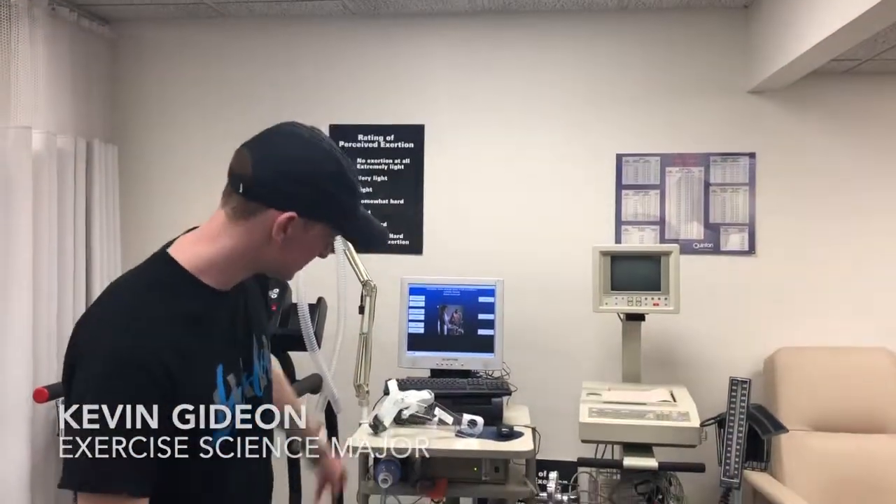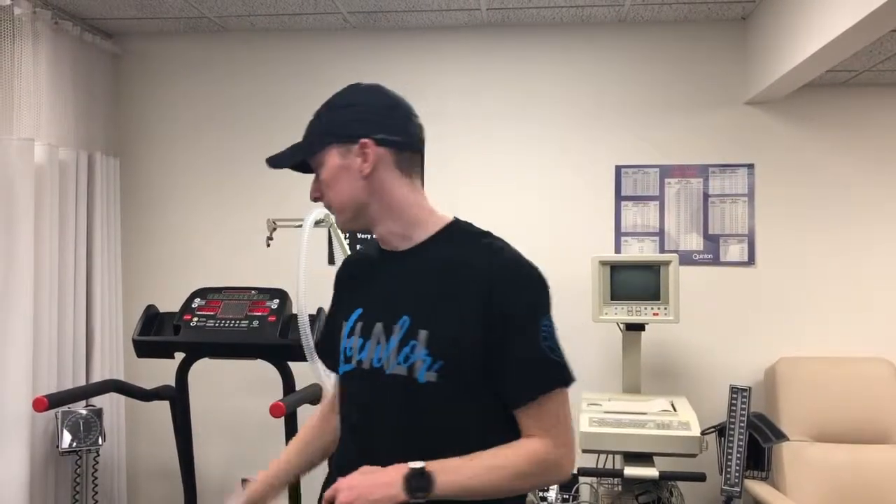Alright guys, today we are going to be teaching you how to set up the Metabolic Cart and specifically the Parvo machine to do VO2 max tests right here.